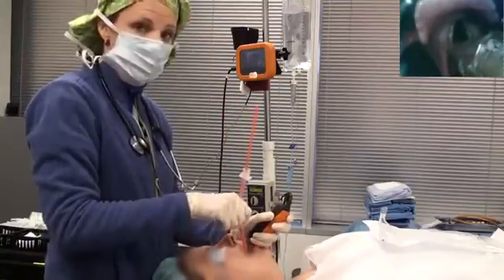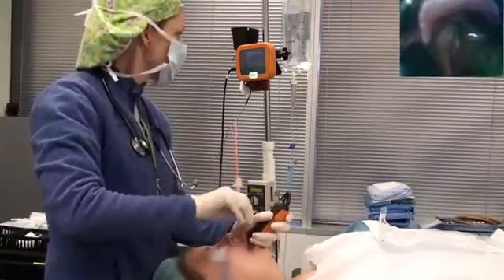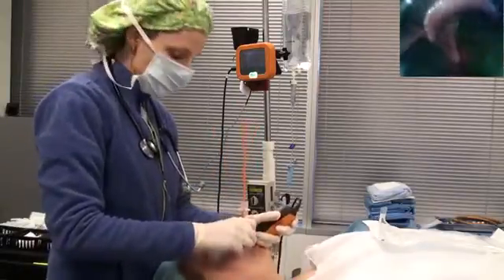If it were to hang up on an arytenoid, all you got to do is turn the tube a little bit counter-clockwise and continue to advance, and then you're finished.